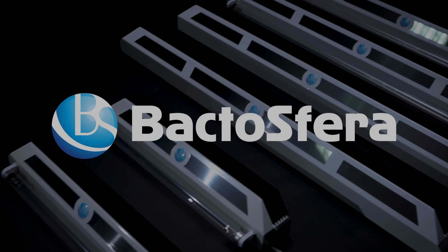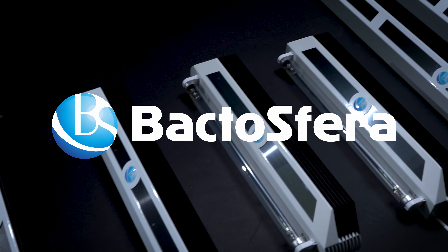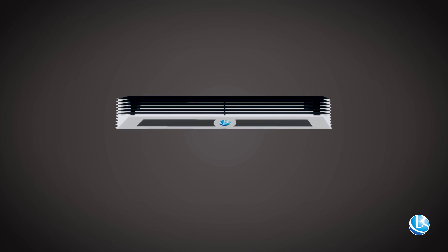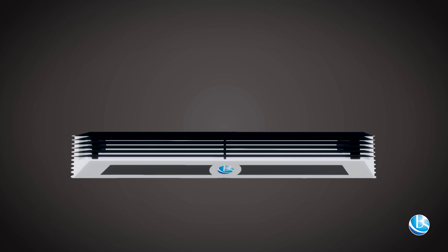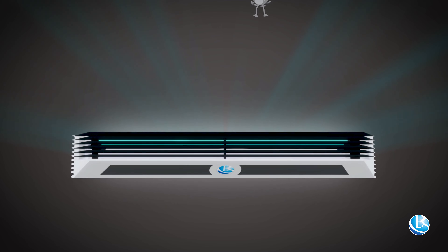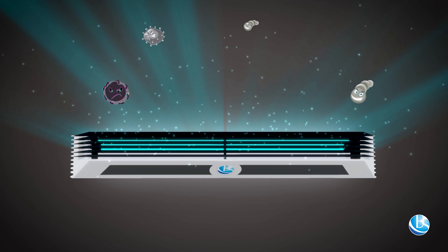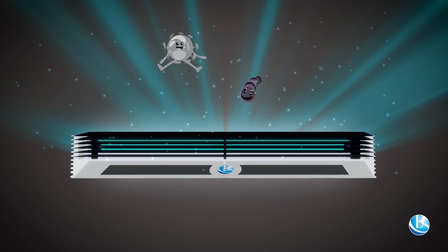Shielded bactericidal irradiators are designed to disinfect rooms in the presence of people. Bactisphaera shielded irradiators with an additional open lamp provide a comprehensive solution for the fight against viruses and bacteria, both in the air and on surfaces.